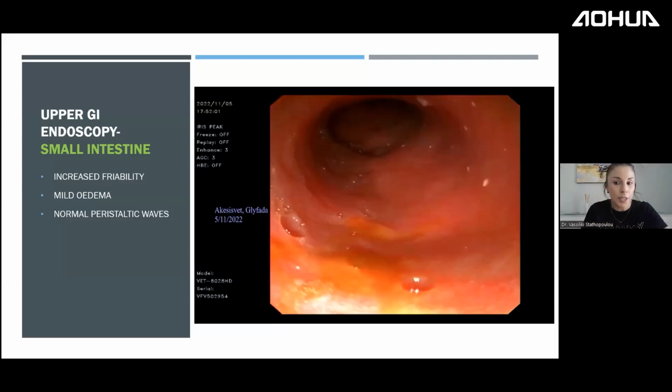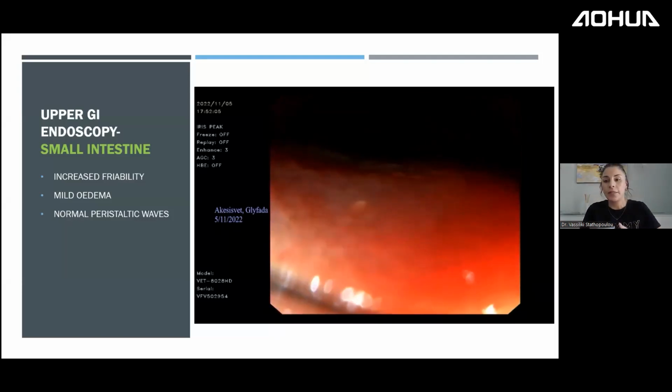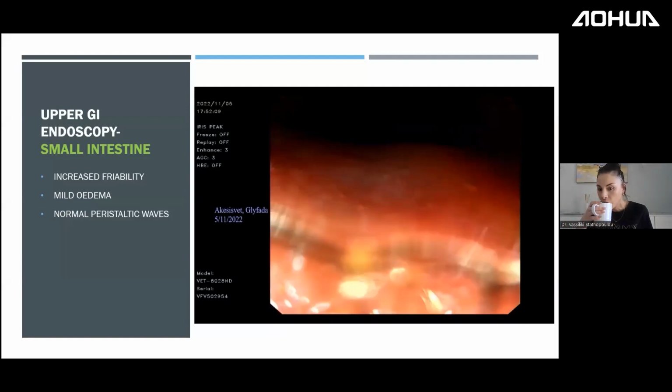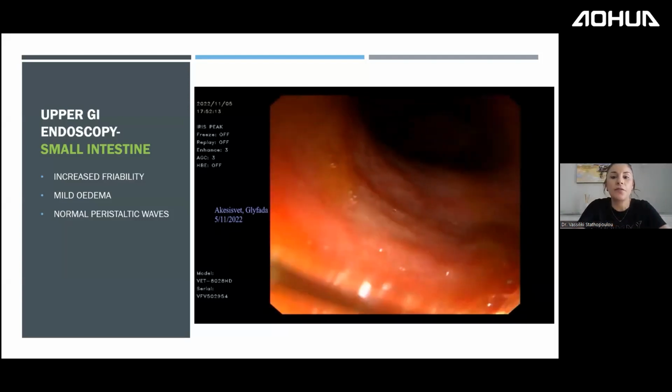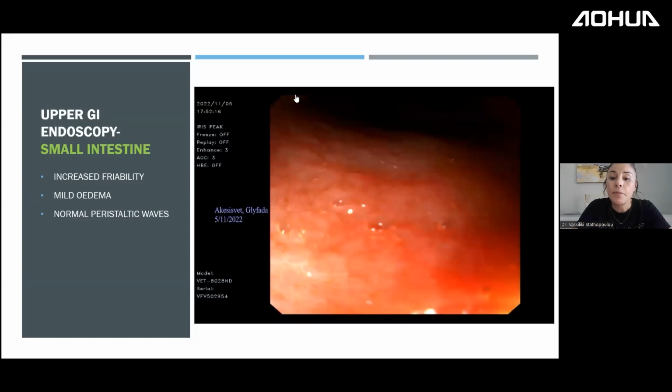You saw a huge lesion in the stomach. Do I proceed to the small intestine? Is there a need? Why should I go into the small intestine? Do you think there was a need for me to go into the small intestine? The best part to take the samples in this case would be the periphery of the ulcer, and also the proliferative tissue that we saw in the antrum.